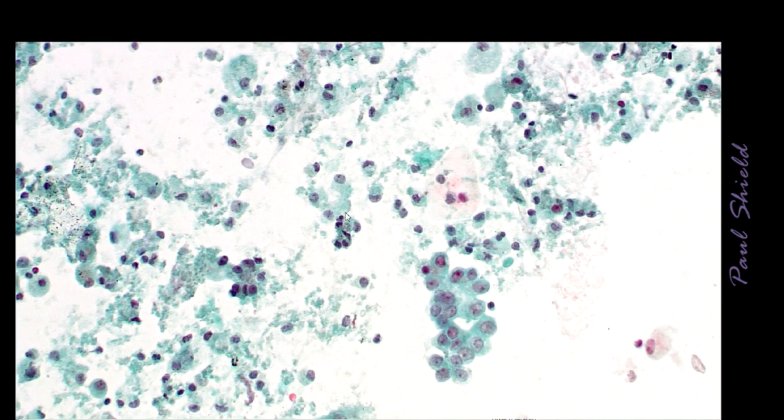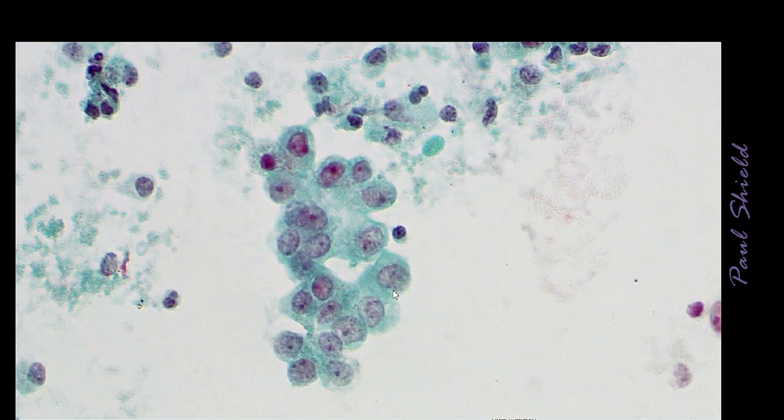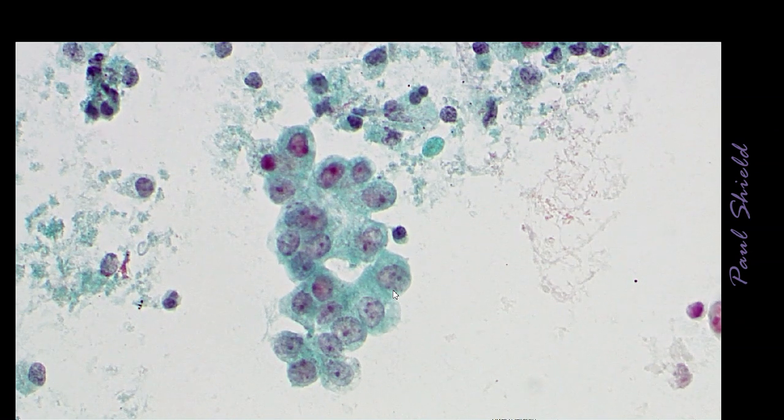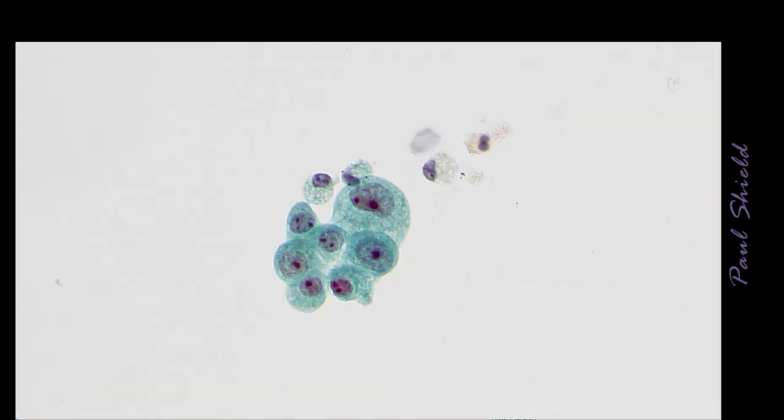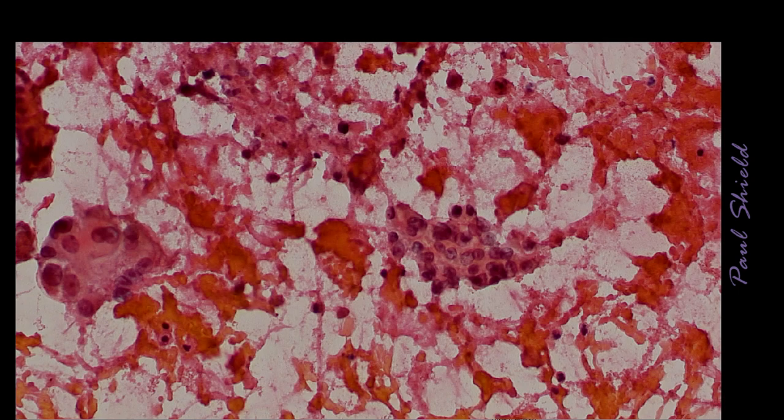You can see there's mainly debris and macrophages here, and then a few groups that are looking different, like this one here. It seems to be more cohesive, nuclei definitely larger, and those same features again, so prominent nucleoli, eccentric nuclei. It's almost like an acinar arrangement, or a couple of them there around a sort of luminal area. Finally, another one, you can see the nuclei really quite enlarged over the macrophages in the background, but very fine chromatin.